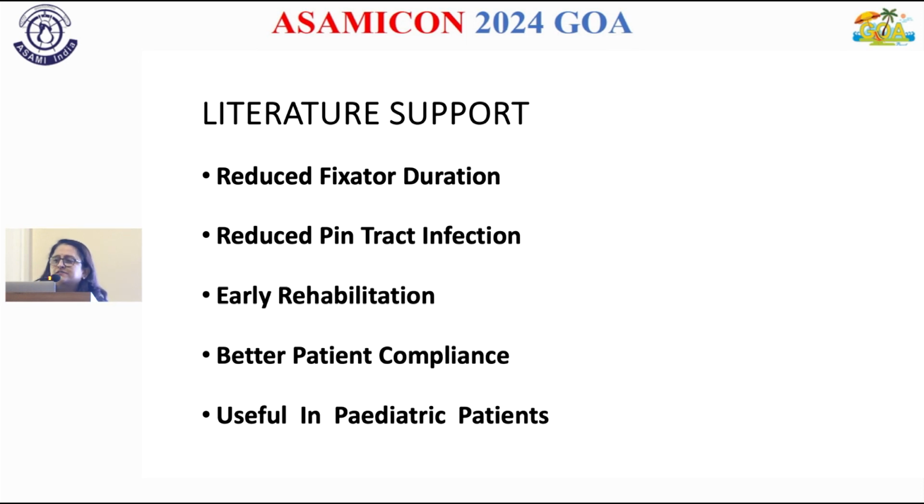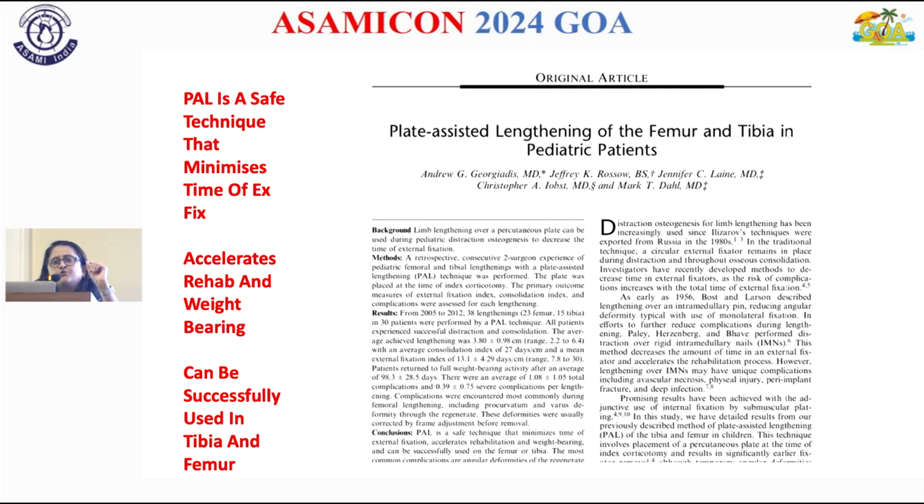So implant-assisted lengthening has these advantages. It reduces fixator period, reduces pin tract infections, early rehab, better patient compliance, and it is useful even in pediatric patients. And last one I would like to add, it is very surgeon-friendly also.